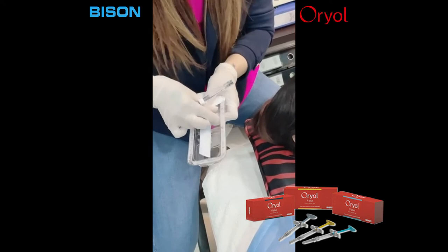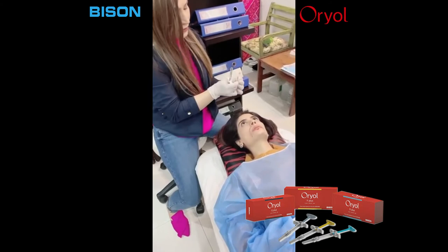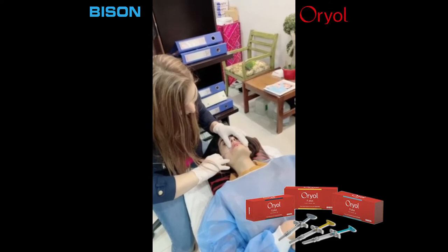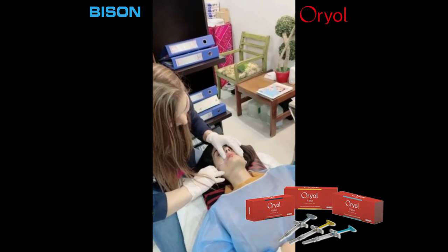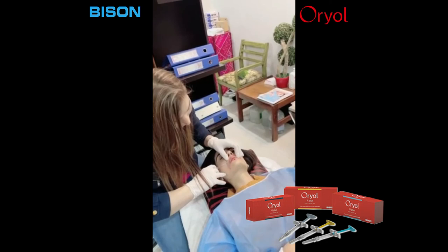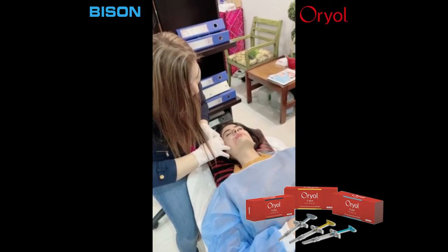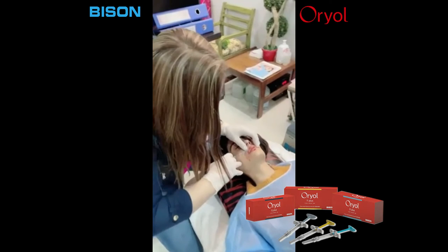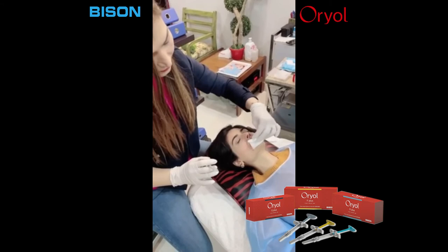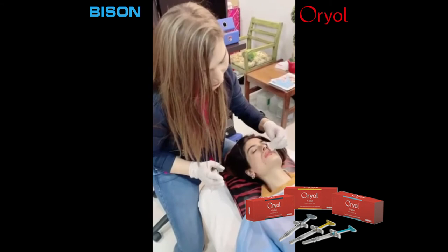There are two needles in it. I'm going to use the 27 gauge one for you. I'm going to massage you as well.